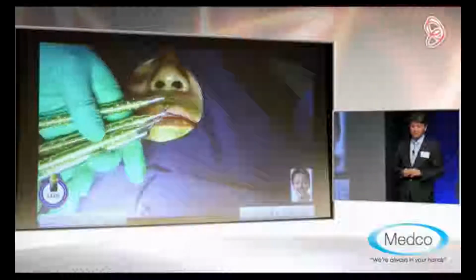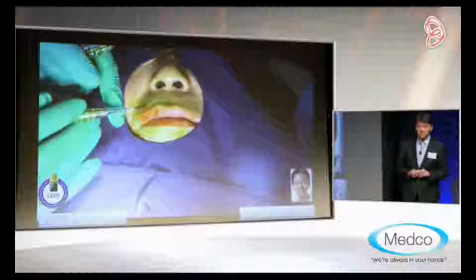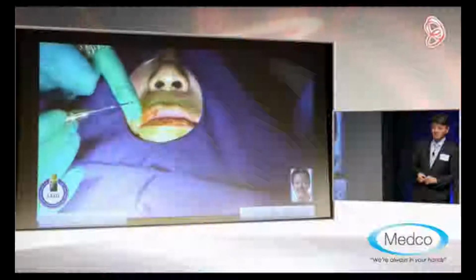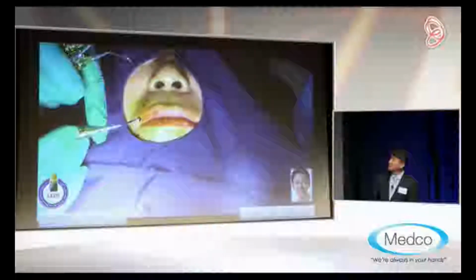So this instrument right here is the key instrument to be able to make a small tunnel and lift the whole gum. It's like doing a facelift. Will bring all the gum tissue down. So this instrument is the key. If you have a bigger space, then you will use this one. Obviously, wider it is, it's more predictable for your technique.